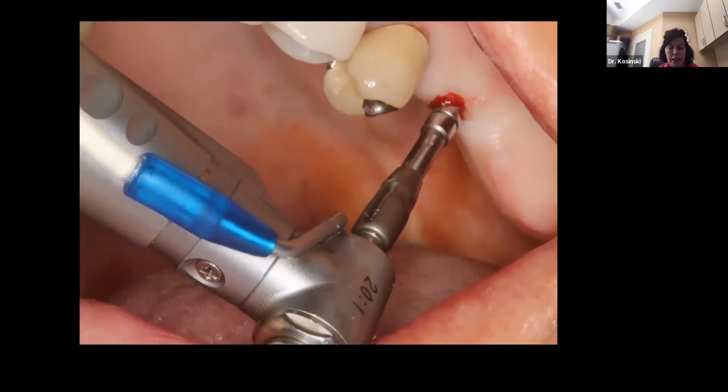I created my osteotomy and can see where I stopped, short of the 8 mm line on the burr, but at the same time maintaining my angulation created by the pilot burr. I can feel that I have not perforated the sinus floor at this point.